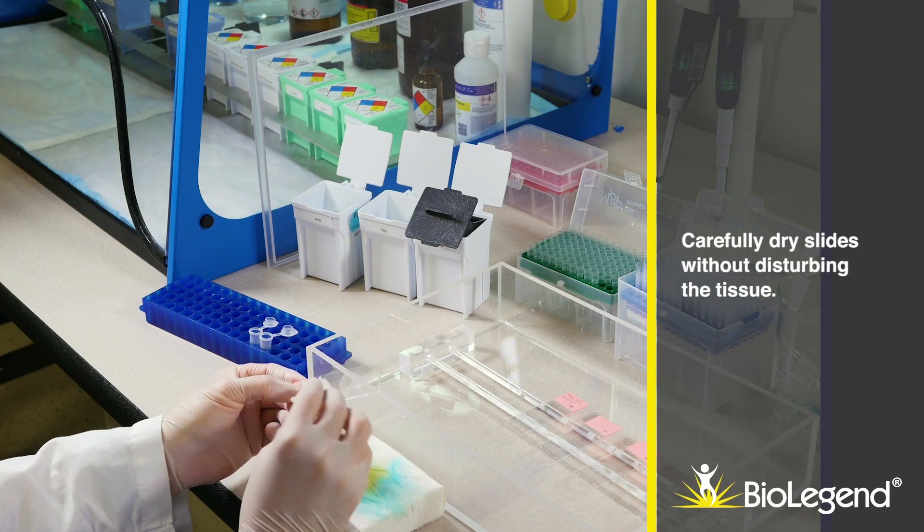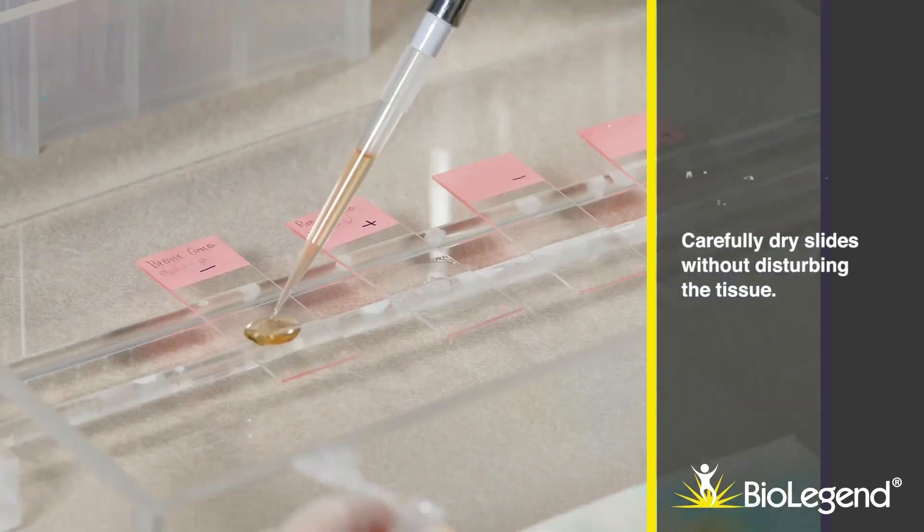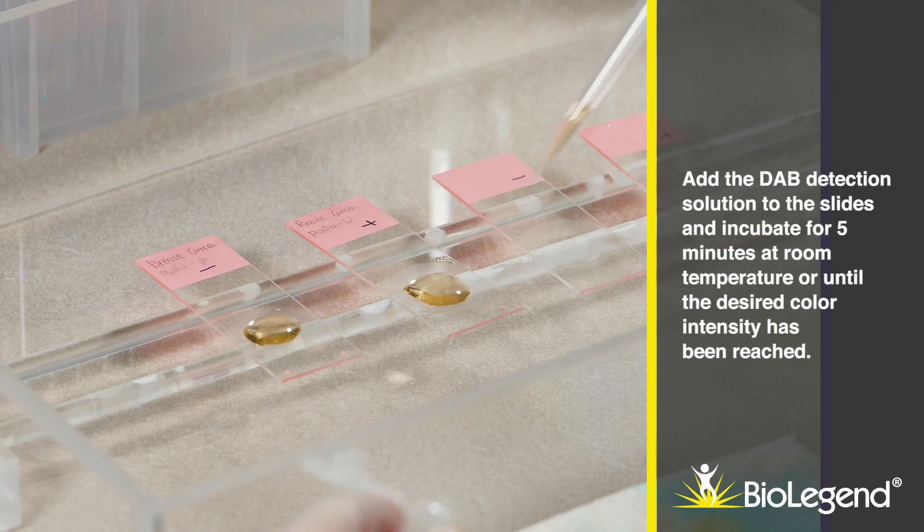Carefully dry slides without disturbing the tissue. Add the DAB detection solution to the slides and incubate for five minutes at room temperature, or until the desired color intensity has been reached.